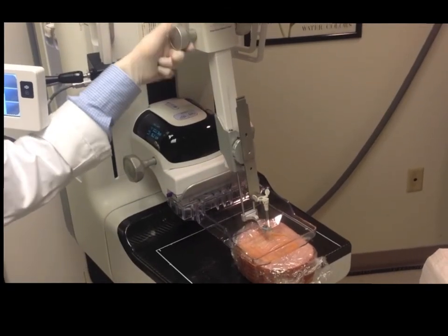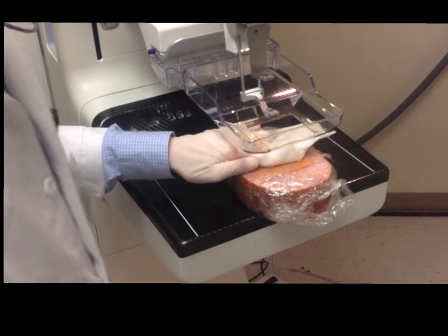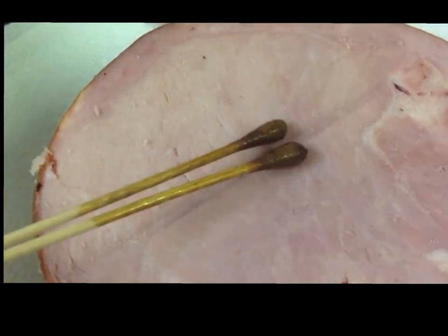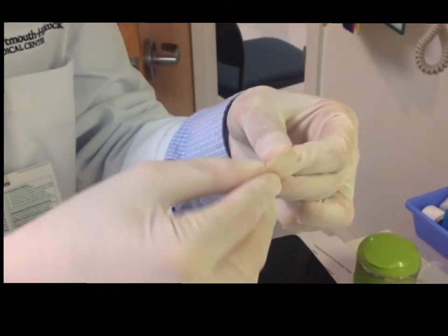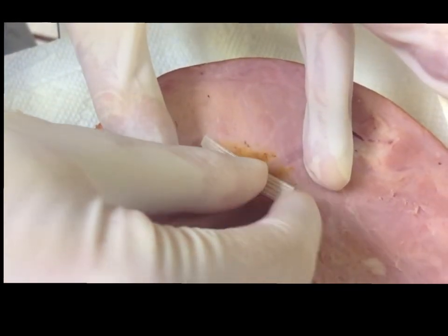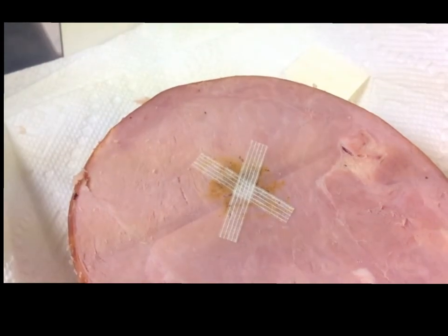Once you've confirmed the clip position, you can rotate the sheath out of the patient, take the compression off her breast and apply some compression to her incision for about five minutes. We would obviously at this point normally be removing the patient away from the device. Over the incision we put a little bit of benzoin compound to help the steri-strips adhere and then we use two to three steri-strips across the incision, making sure you efface the edges nicely. The technologist will, after she has performed the post-procedure mammogram, which we're not going to show, which you use to confirm clip position, put a compression bandage on the patient. Don't forget if this was a TOMO-only visible lesion that you are biopsying, you should do a 3D mammogram after the procedure to check the clip position, not just a 2D. And that's pretty much it.